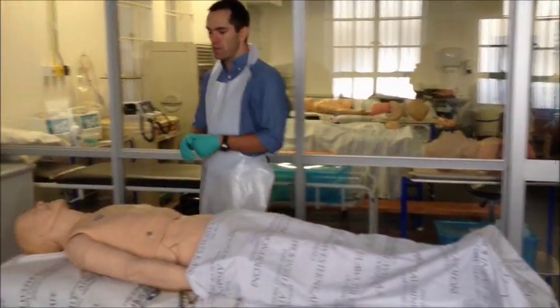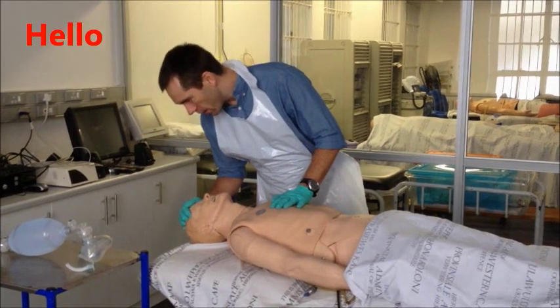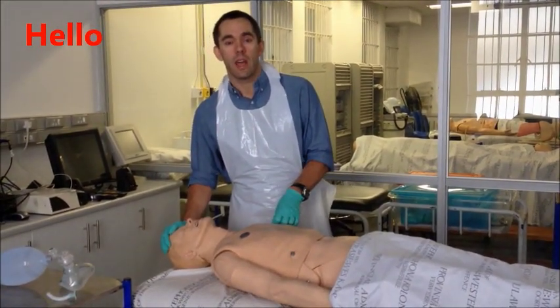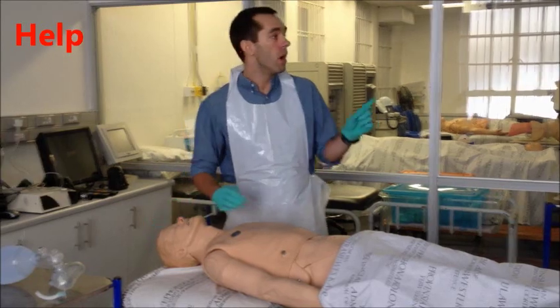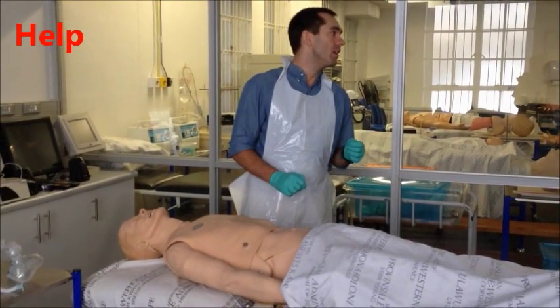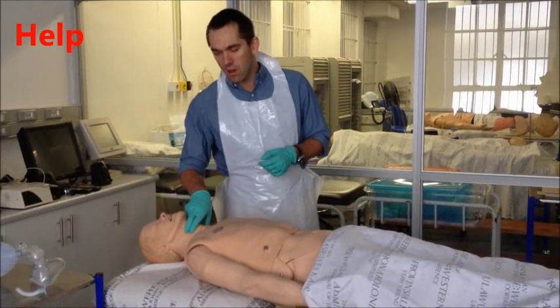I then check responsiveness. Hello there sir, how are you doing? If there is no response, I assume cardiac arrest and activate my help system. Mohamed, go get us some help, bring me the resuscitation equipment and the AED as soon as you can.